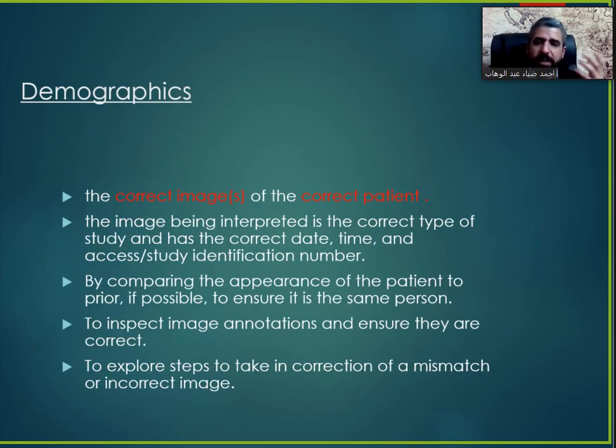First of all, regarding the demographics, it helps us to ensure that these are the correct images for the correct patient, the image being interpreted is the correct type of study, and it has the correct date, time, and study identification number. By comparing the appearance of the patient to the prior one, if we have the prior study, we compare the new one to the old one to ensure that this is the same patient, not a different patient by any mistake.